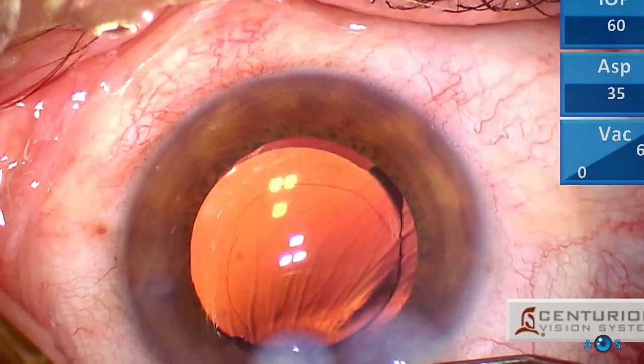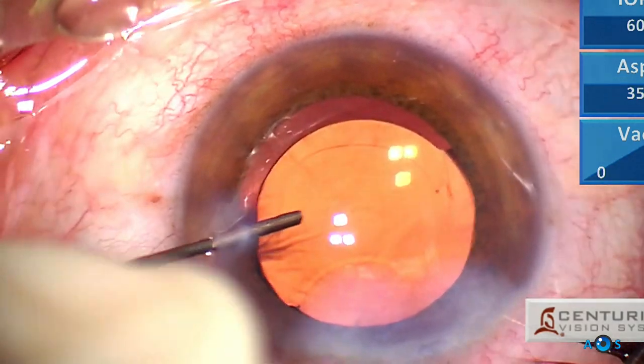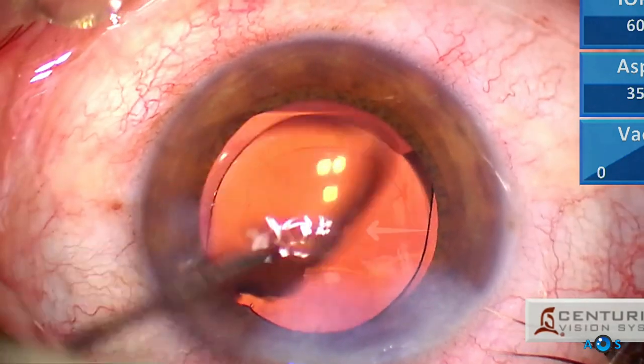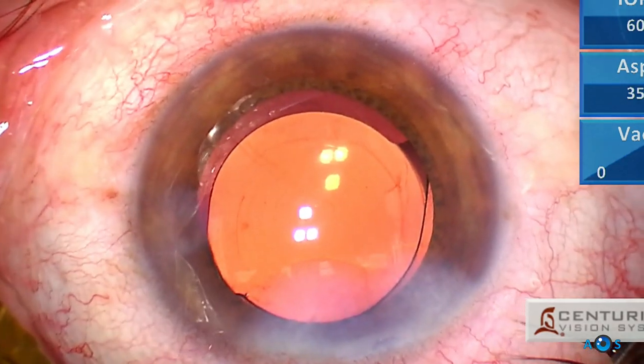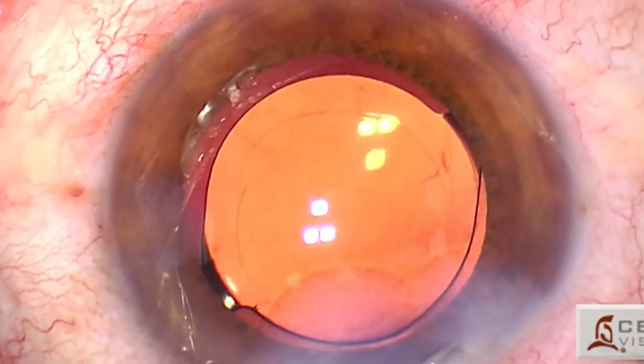The mix and match strategy has been used since the days of the first bifocal diffractive lenses with differing near powers, but now more than ever, with different technologies combining non-diffractive and diffractive optics, this strategy may bring fully functional spectacle-free vision to most patients.